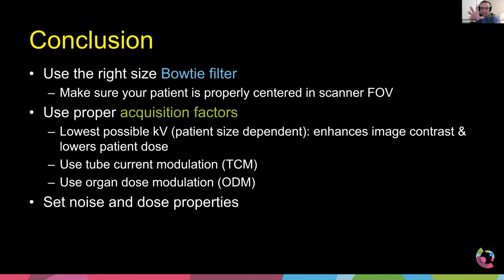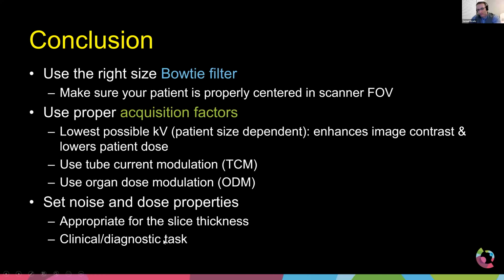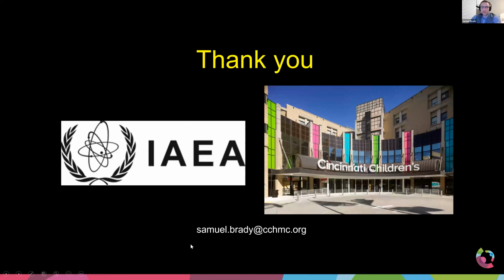We reviewed that. I've given you now several different equations in this presentation, so that you can use those to do your calculations before you make changes. And then how do you set that for the proper slice thickness, clinical diagnostic tasks, etc. All right. So I think we can turn it over for questions now.